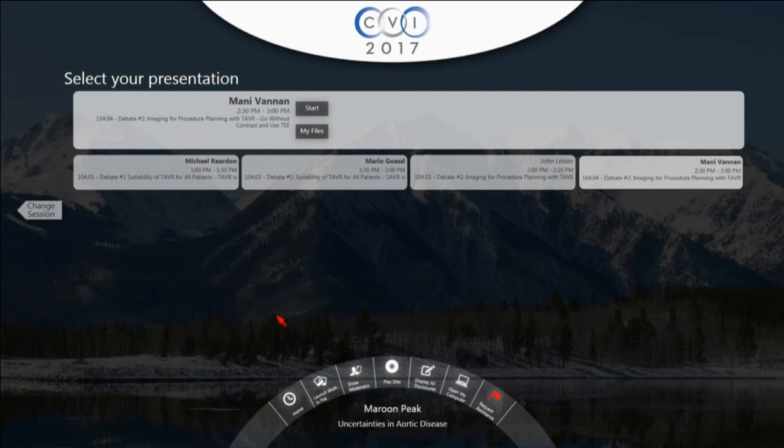But remember, it is still an echo problem. It's an ultrasound issue. There's nothing you can do. You can do 8D if you want, but it is an ultrasound, right? Because in ultrasound, we have to track something for automation. And we track the black-white interface, which is the most reliable one. If you go inside the white, it's all shades of gray, and then we run into a problem of unreliable tracking. So it doesn't matter whether it's 3D or 2D. I think the numbers will always be a little smaller than CT.